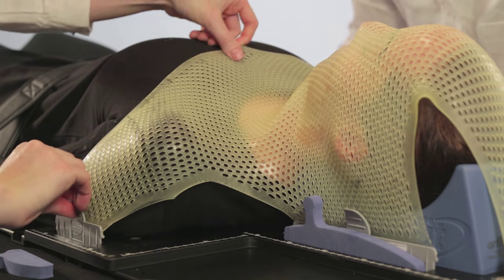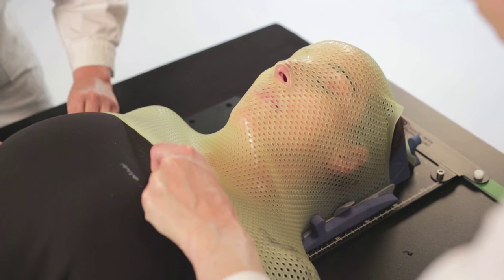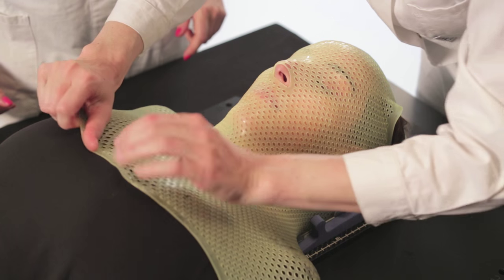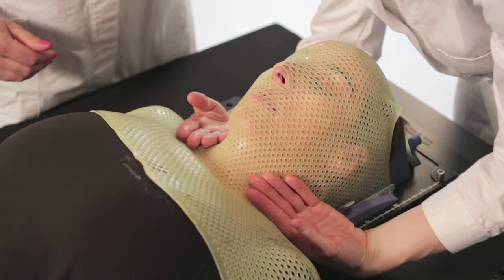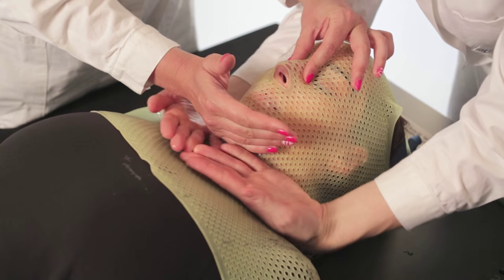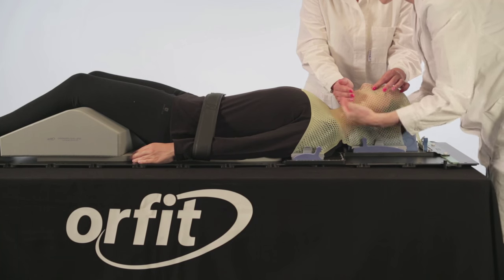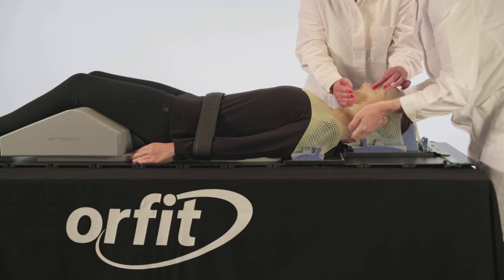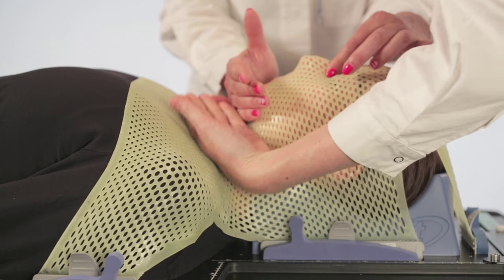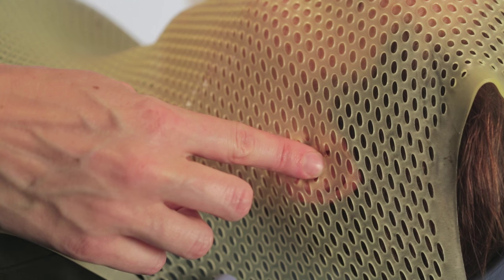Pull the mask around the shoulders of the patient and insert the shoulder profiles in the base plate. Mold the mask around the shoulders and in the neck area. Make sure that the mask covers the chest area sufficiently. Continue to mold the mask closely over the neck, shoulders, chin, and nose bridge of the patient. Push the material slightly into both ears to serve as reference points for the patient.